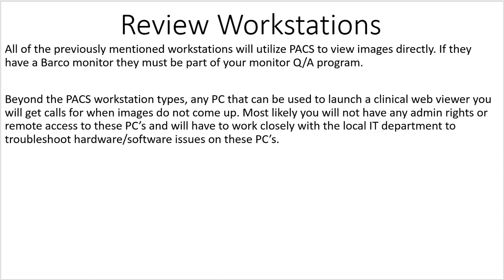Beyond the PACS workstation types, any PC that can be used to launch a clinical web viewer, you will get calls when images do not come up. Most likely you will not have any admin rights or remote access to these PCs, and you'll have to work closely with a local IT department to troubleshoot hardware, software issues on these PCs.